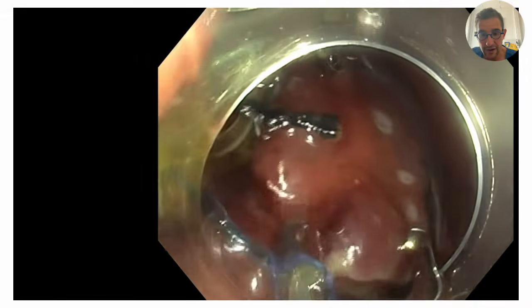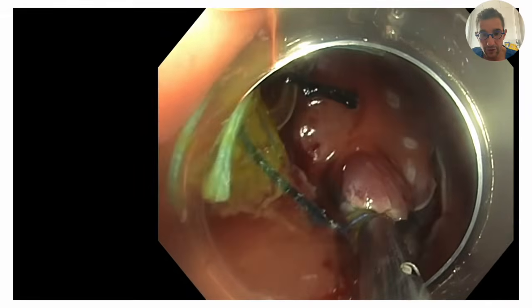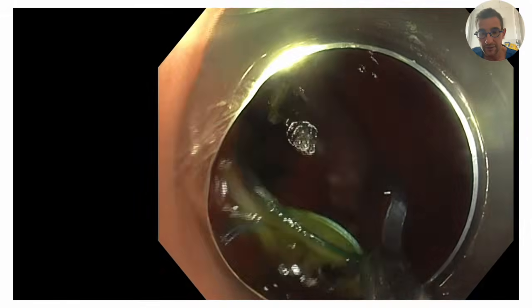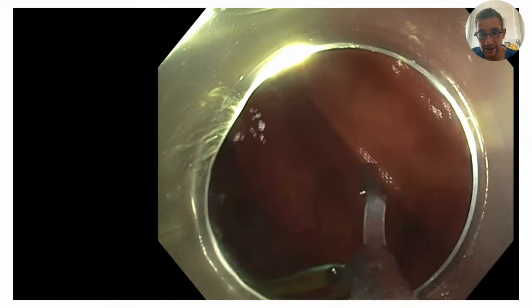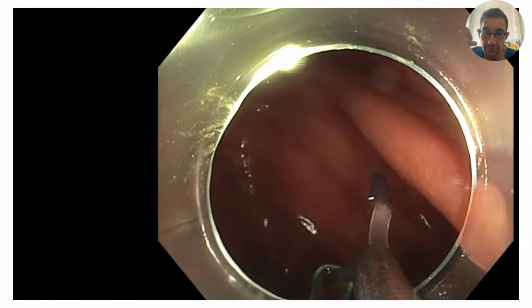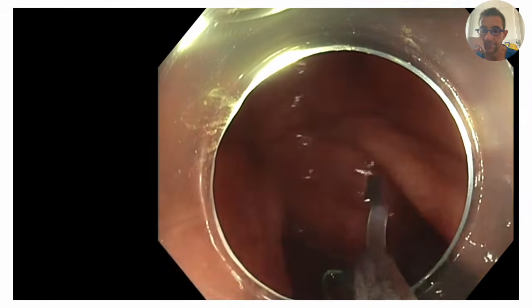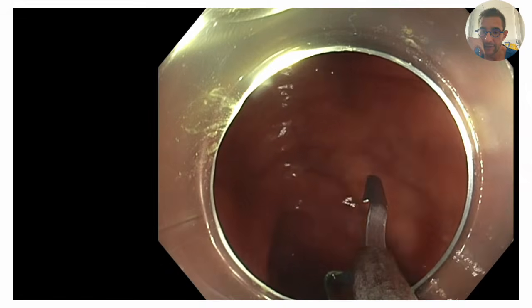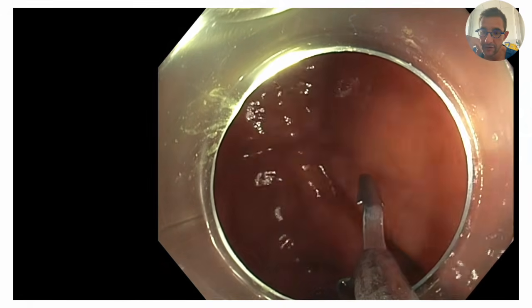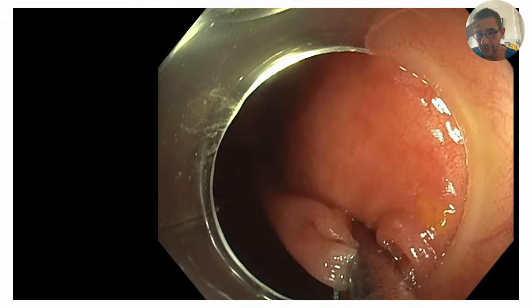And therefore, having something that is able to be stretched again at the middle, but which is strong enough at the beginning to enlarge the space from the beginning, is really helpful, I think, because it will help you at the two most important steps of the procedure.